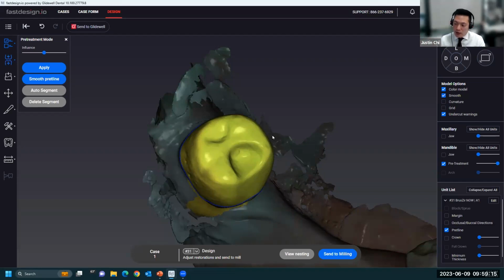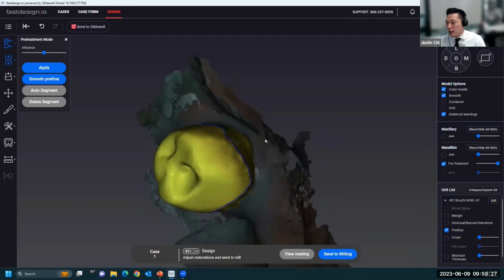Too much reflection is also bad, which is why we want to turn off our overhead lights and reduce the amount of ambient light into the intraoral space. In this case, we applied a little bit of occlusal or intaglio check spray. It's a really fine spray, and that did dull the restoration down quite a bit.